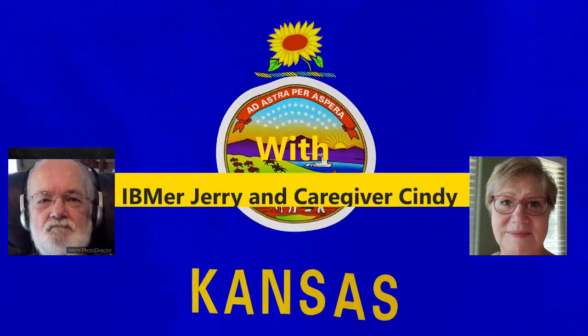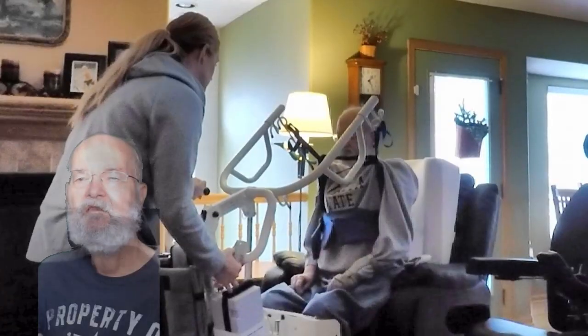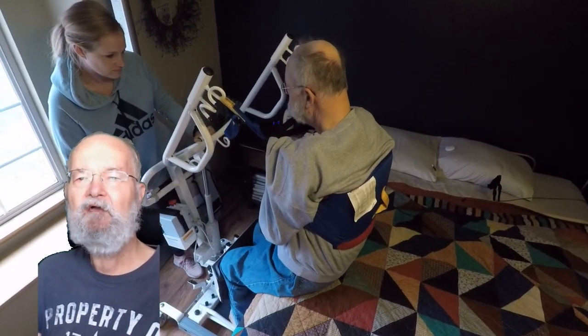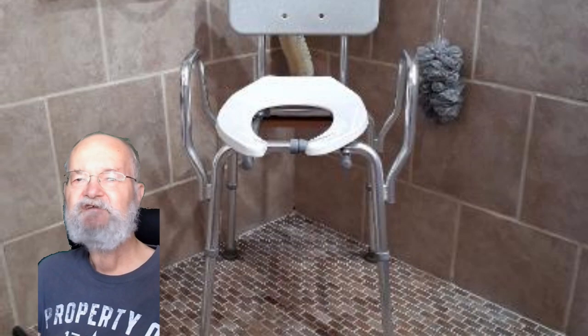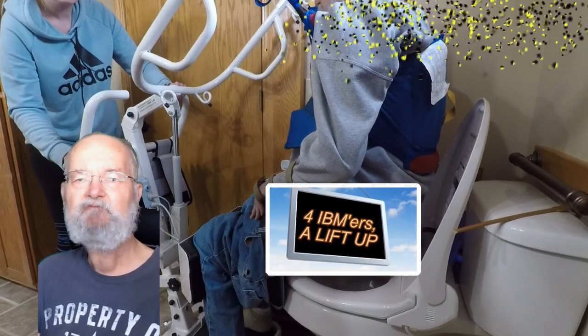The around-the-torso sling used with my sit-to-stand lift is used to transfer me from point A to point B, or sometimes just to reposition me when I've slid forward on the chair I'm sitting on. I also use the sit-to-stand lift to get in and out of my bed, onto my power chair, onto my shower chair, and to get on and off our master bathroom's toilet as well.